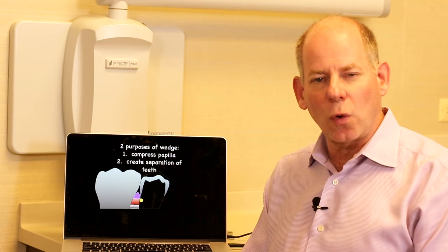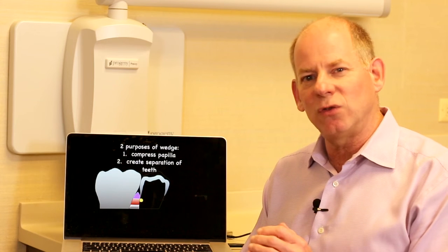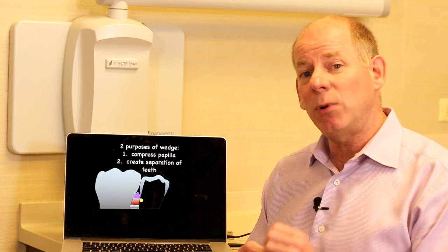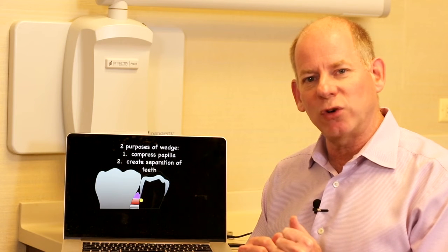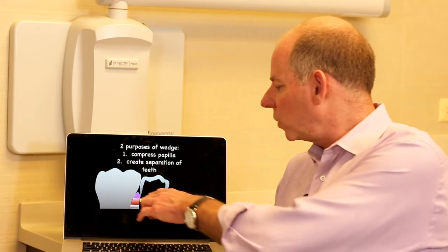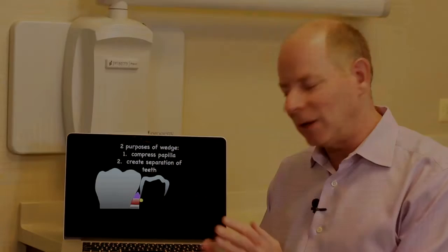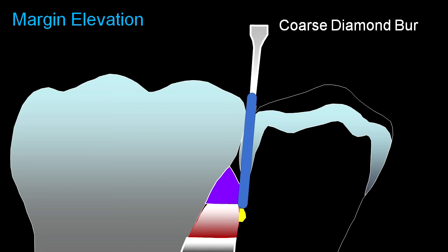I'm going to wedge with significant pressure. If you've taken my class 2 course, you'll know I tell patients I'm going to be placing a spacer between your teeth — I don't say wedge because that sounds scary. I say you're going to feel some pressure but it shouldn't hurt. This is also a great way to verify your patient is anesthetized. Lots of pressure with this wedge trying to gain separation. I typically start with a 330 carbide bur through the enamel or old restoration, then follow up with a coarse diamond bur, with the goal of removing the pre-existing restoration and getting down to the caries.